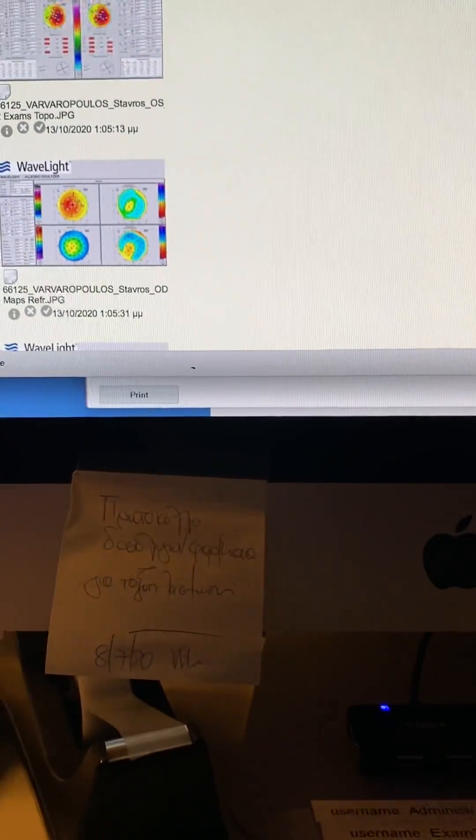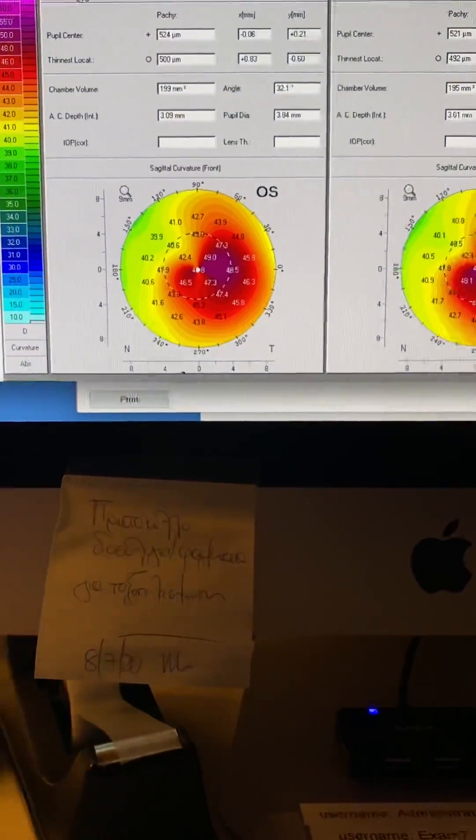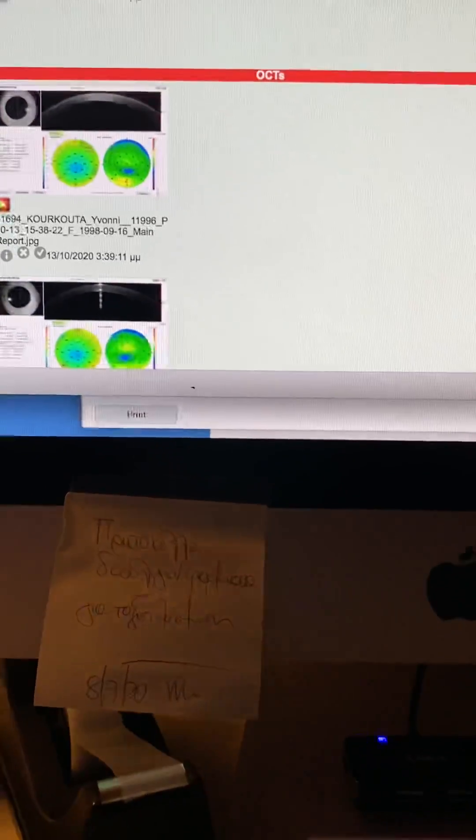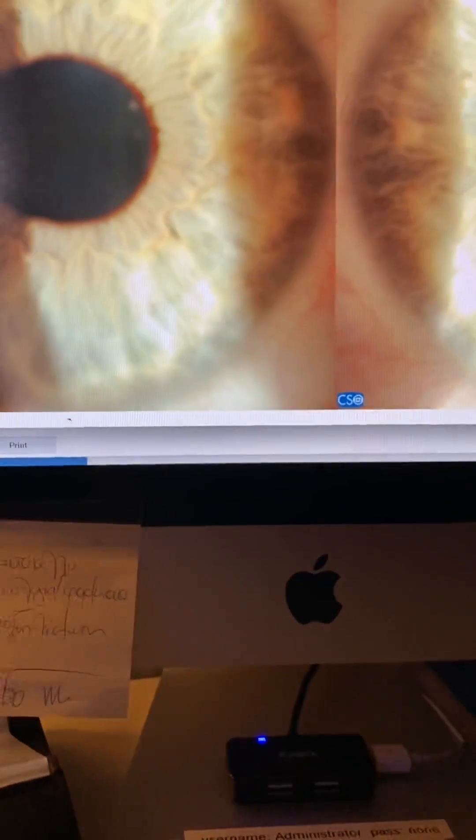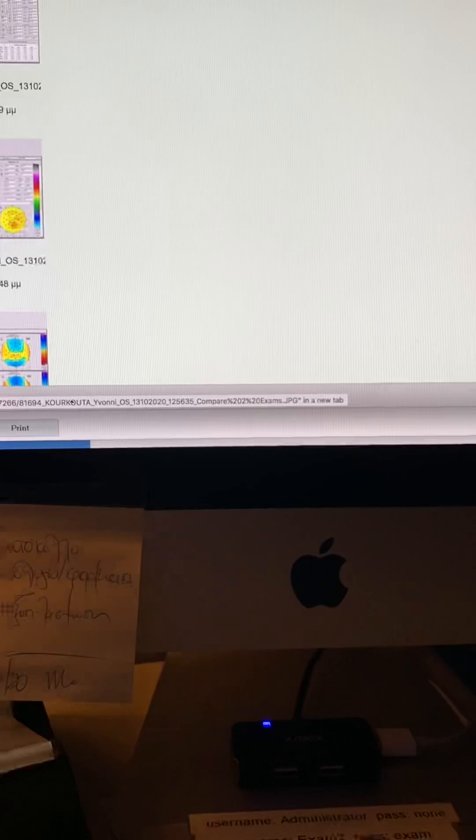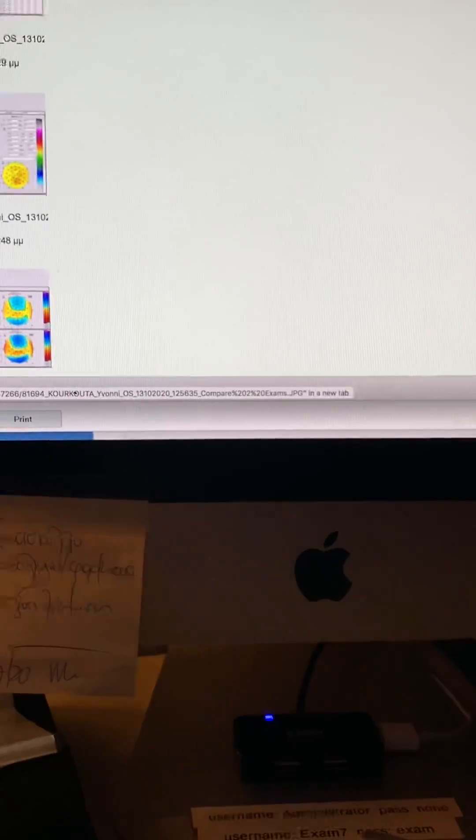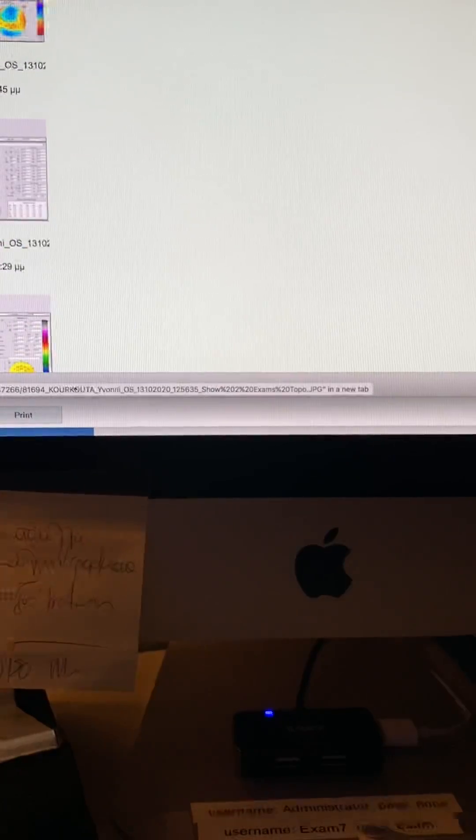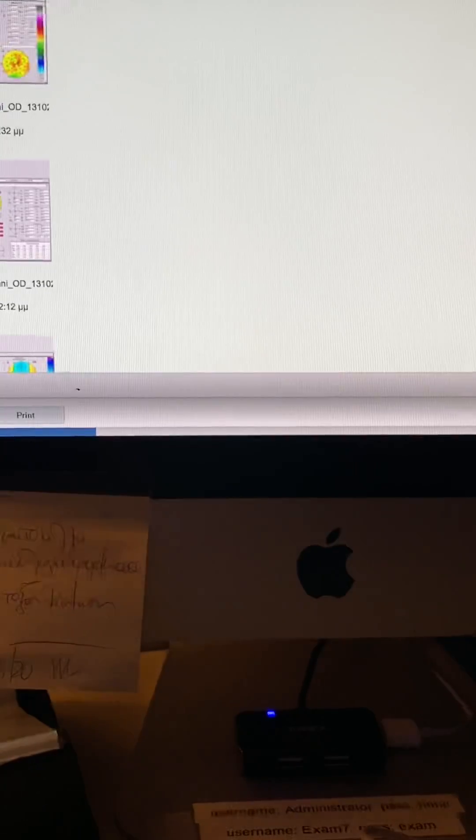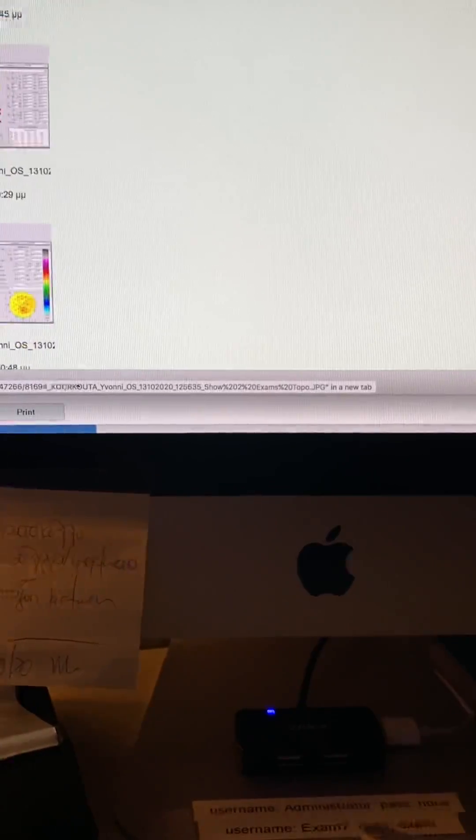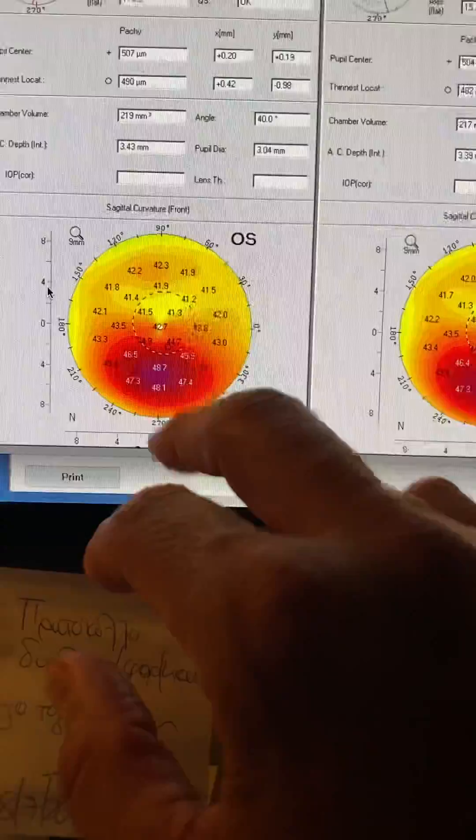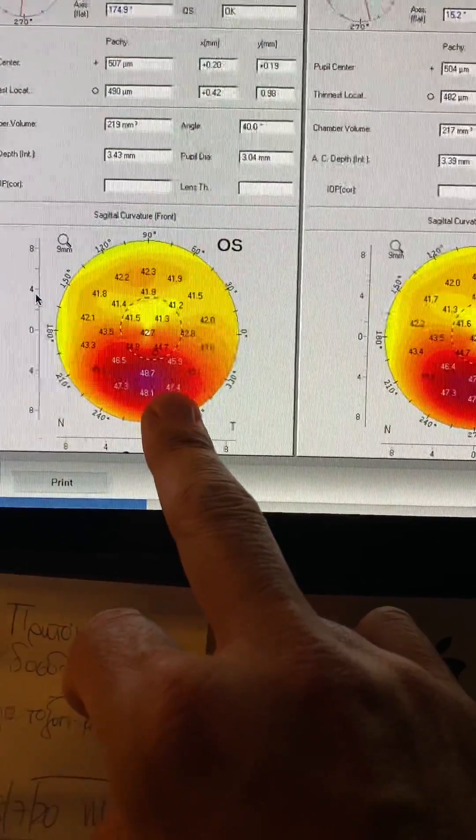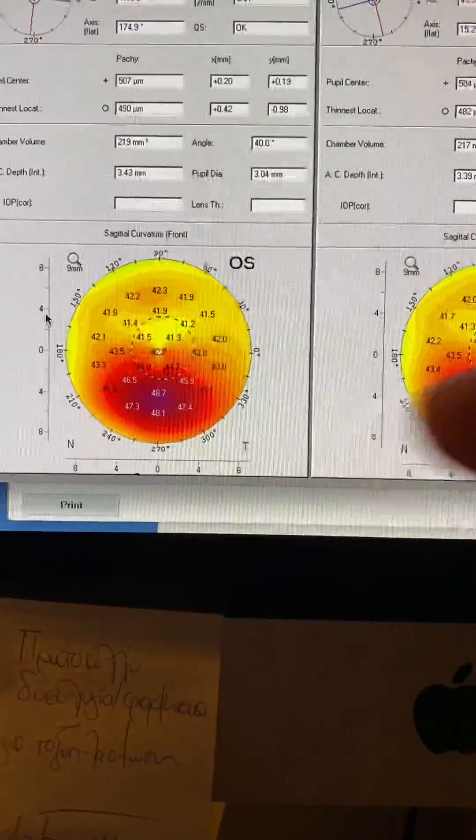We're going to jump from this gentleman and the impressive images that we saw to a young lady. And this lady, besides having beautiful eyes, she's in her 20s. And let's look first at her Pentacam scans. We're going to look first at the milder right eye, actually left eye.